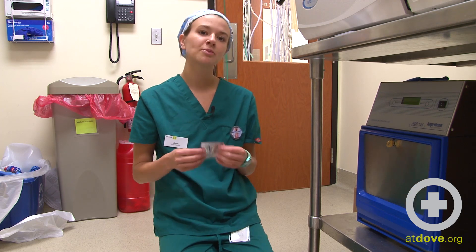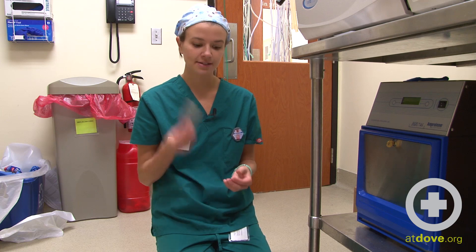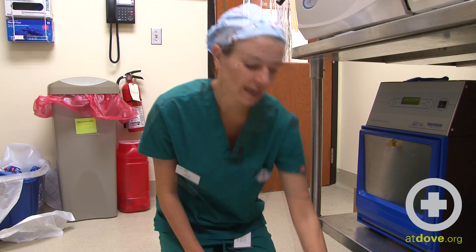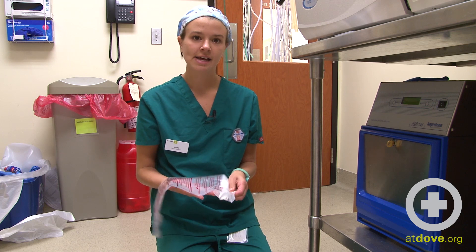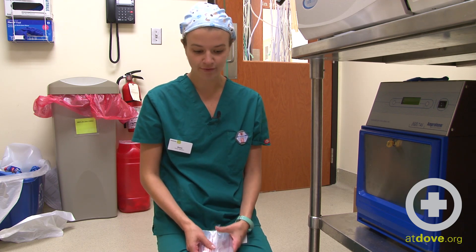I have a humidity chip. Humidity is very important to the sterilization process when you're using ethylene oxide, so I have one chip here, and then I have my ampoule that contains the ethylene oxide that will actually sterilize the items that I have wrapped here.